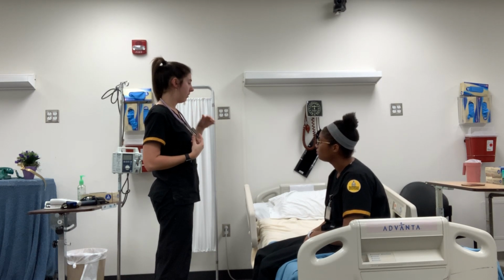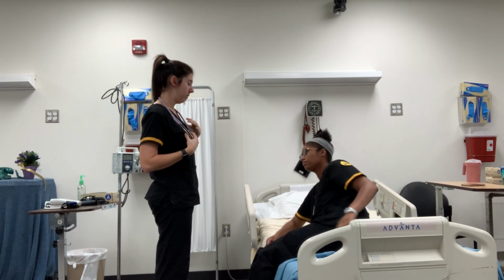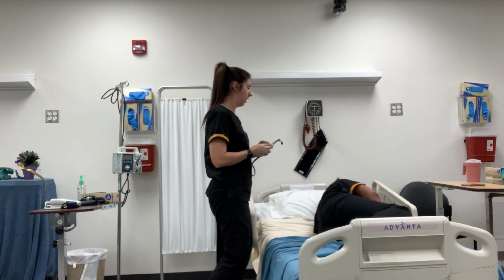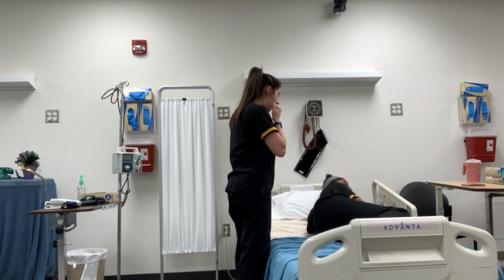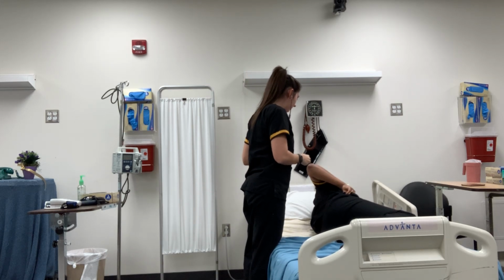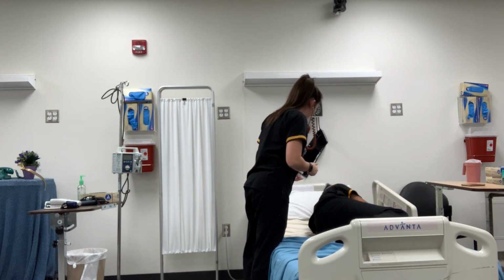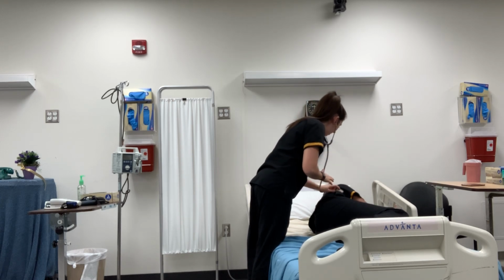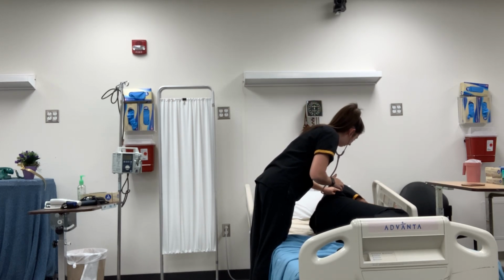So I'm going to go ahead and have you lay on your lateral side for me, please. And I'm just going to finish off checking that there are no murmurs and no abnormalities using the bell of my stethoscope. We're also going to be listening to S3 and S4 sounds of your heart if there are any apparent.